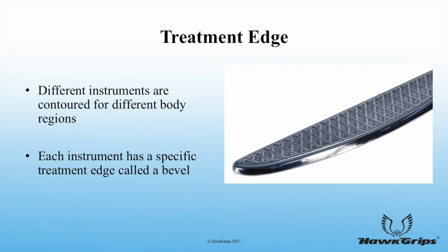The multiple instruments are contoured for different body regions. Each instrument has one or more specific edges called a bevel that are optimal for treatment. During treatment, it's likely that multiple instruments will be used.